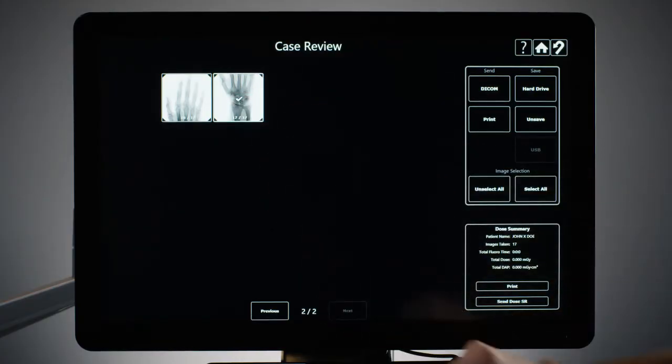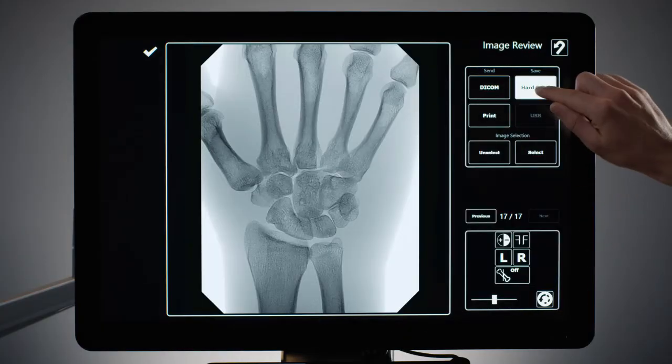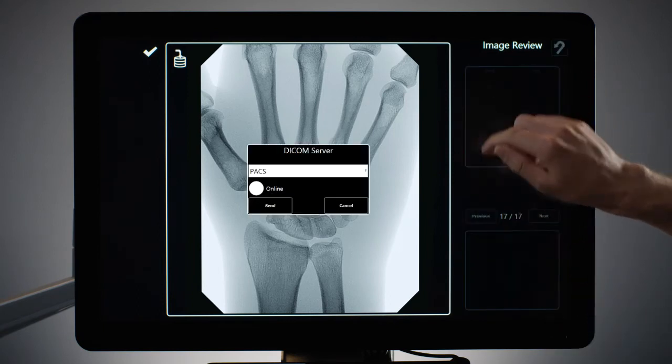After completing a patient exam, you can easily review, save, and transfer images to your PACS or EMR system via the intuitive OrthoTouch display.